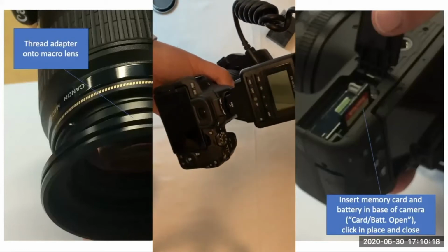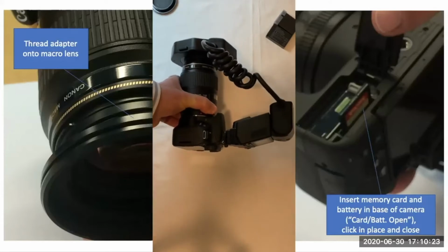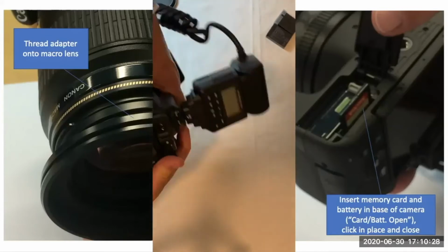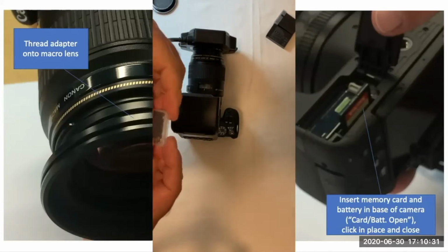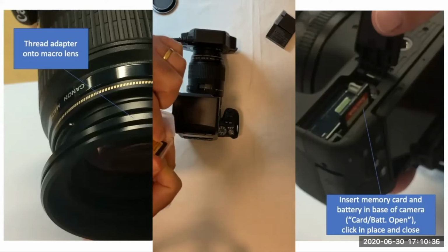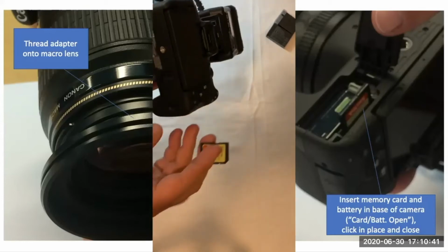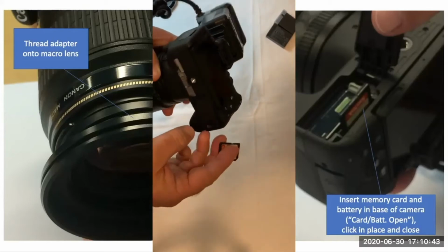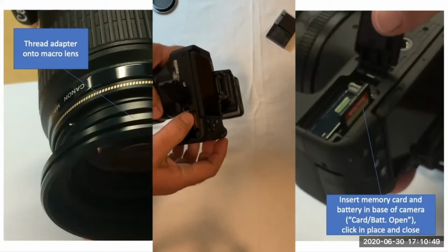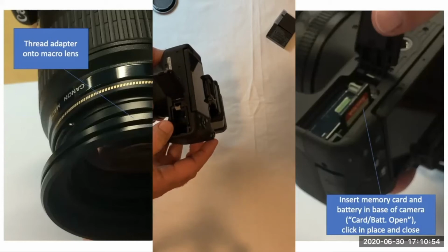So we've got the camera and the ring flash in position. The next thing is to make sure that whatever photographs we take get recorded on our compact flash or SD card. There are various types of this. Hopefully you've got one that has plenty of space on it to keep your images, but you're going to keep taking the images off all the time anyway. There's really only one way that slides in, and as you push it in, it grabs hold of it and keeps it in position.